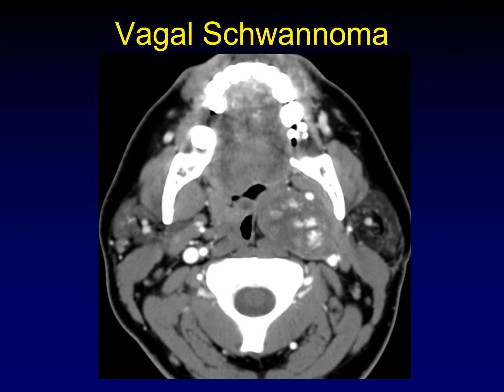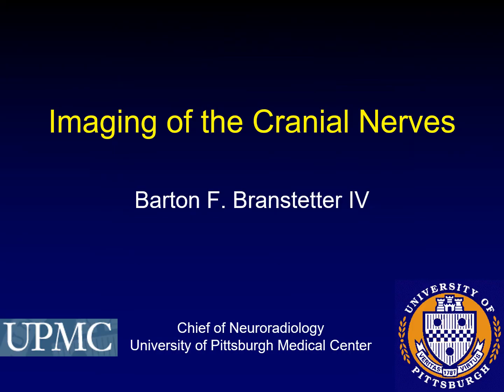Here's a very similar-looking lesion, once again splaying the internal carotid artery away from the internal jugular vein. However, this shows heterogeneous patchy enhancement with areas of non-enhancement and areas of extensive enhancement in a geographic distribution — characteristic of a schwannoma. The location identifies this as a vagal tumor, and the enhancement characteristics help distinguish schwannoma from paraganglioma. This ends part five of the lecture on imaging of the cranial nerves — one more to go.